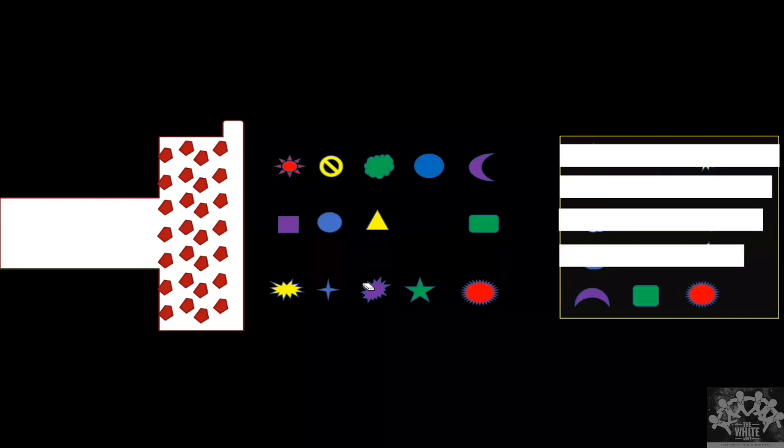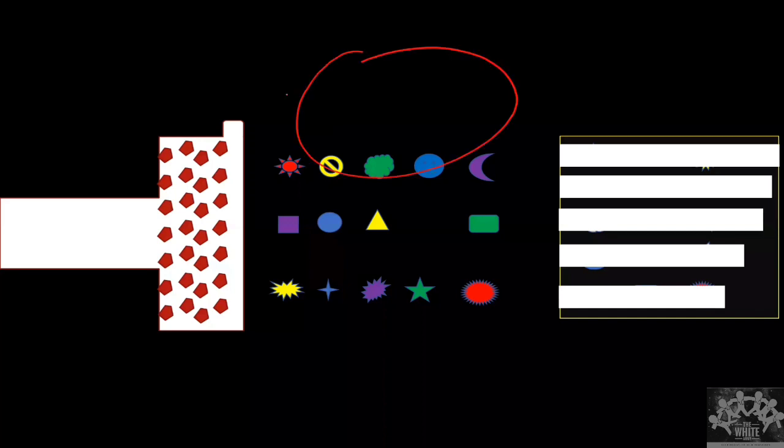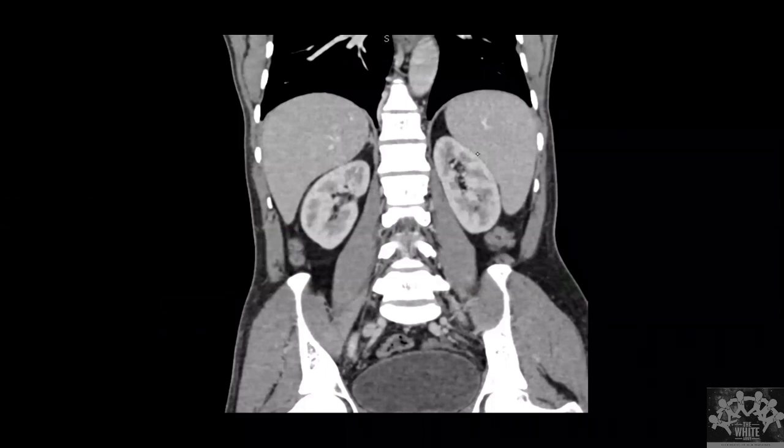So what this can tell us is, if this is my orbit, there is one structure at this level, one at this level, one at this level, and so on. Multiple lines tell us that there are structures at different levels. That's all; it doesn't tell more than that. So that is the amplitude scan. I'll show you the image of an amplitude scan.